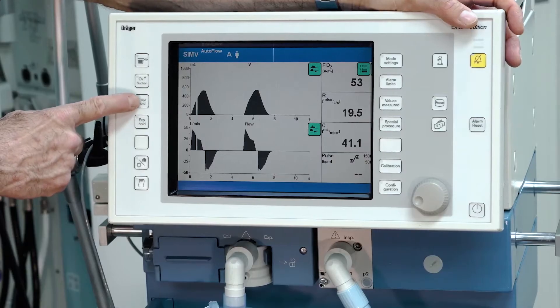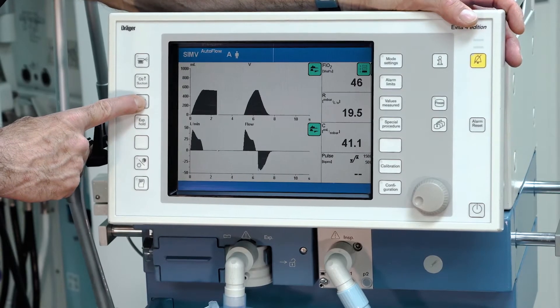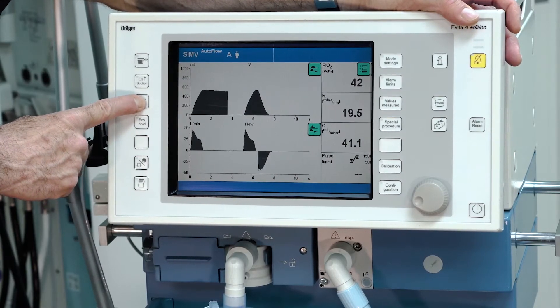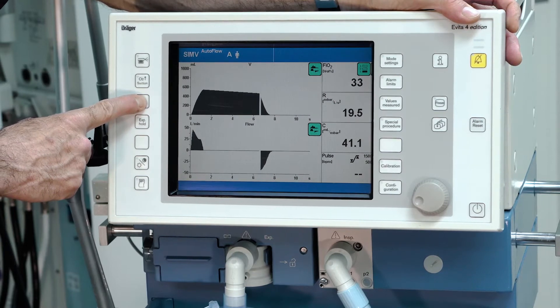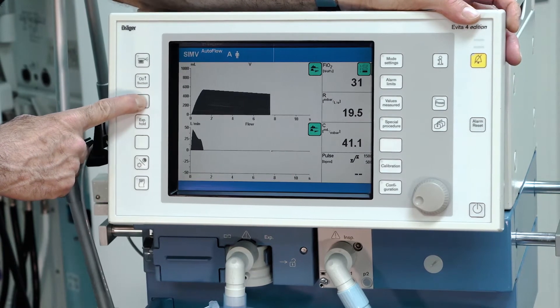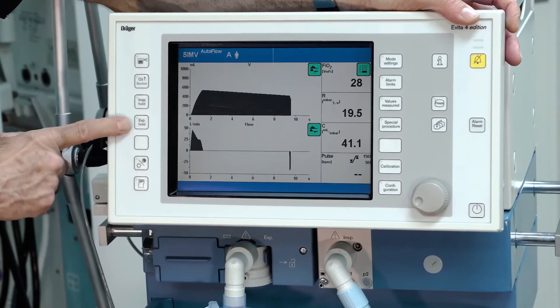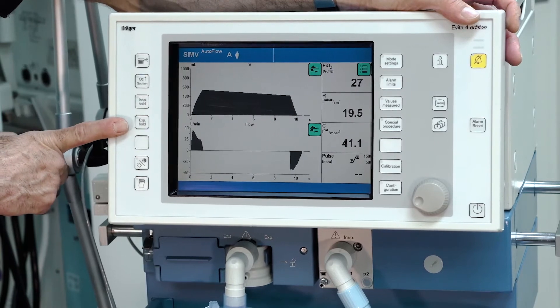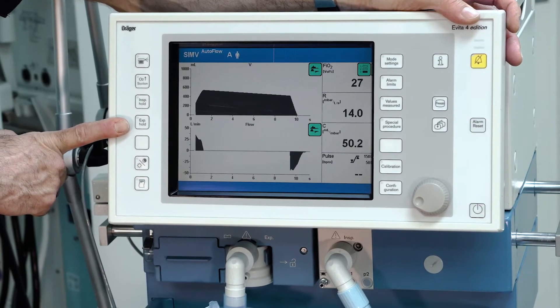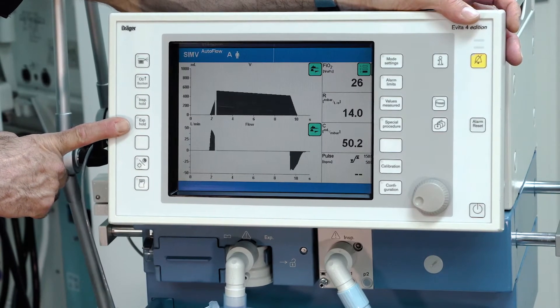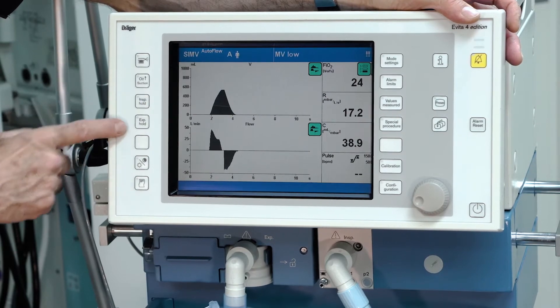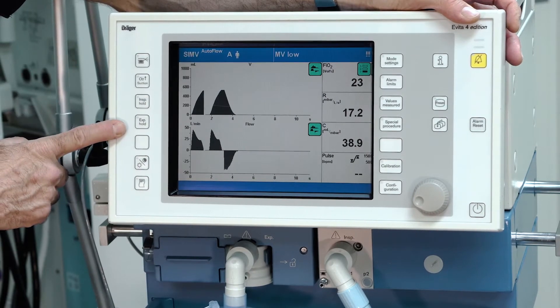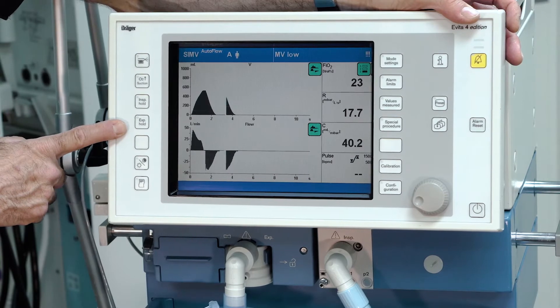For inspiration hold, press the inspiration hold button and the inspiration will be held as long as you press the button. If you release the button, inspiration hold is finished. With the same button, you also have the possibility to start a manual inspiration by pressing the button once.